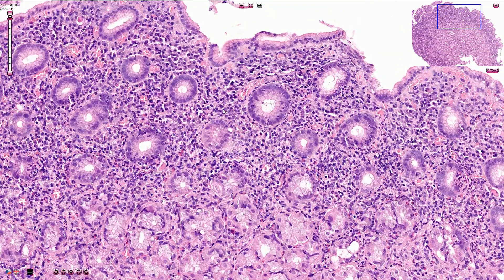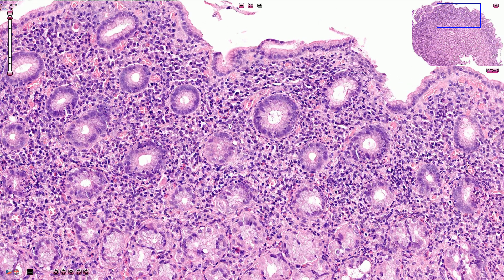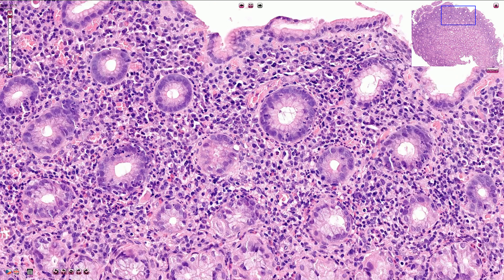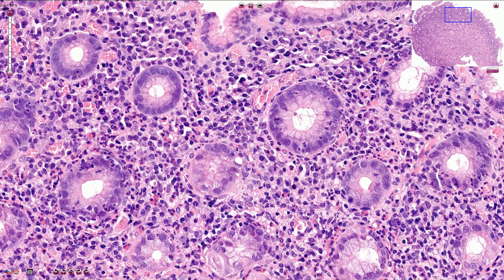Now let's pay attention to the lamina propria. In the normal lamina propria we should see just very few lymphocytes and plasma cells, but here we have a quite dense inflammatory infiltration. It consists of lymphocytes, plasma cells with eccentrically located nuclei and more voluminous cytoplasm, and also neutrophils. We can even find neutrophils infiltrating the epithelium of the foveoli.